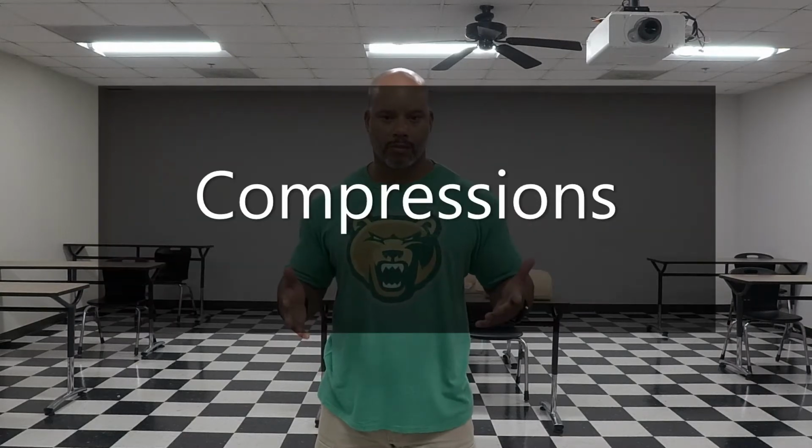All right, the next thing will be the treatment. The treatment is all about the compressions. We're going to go into detail about the compressions later on in this video.